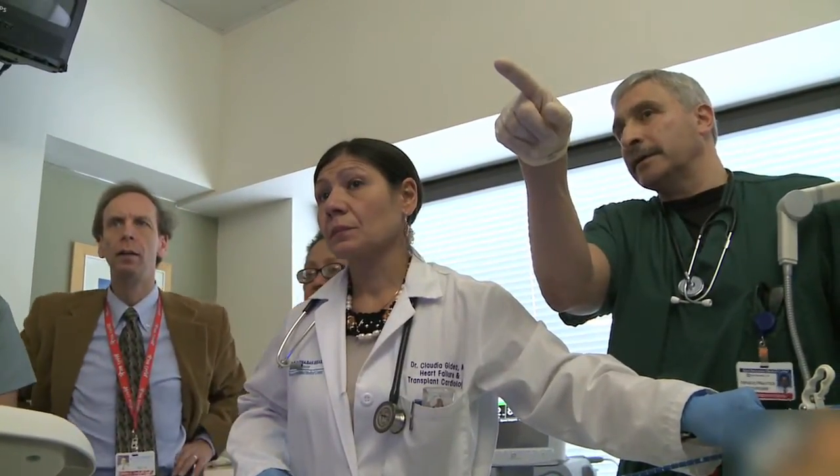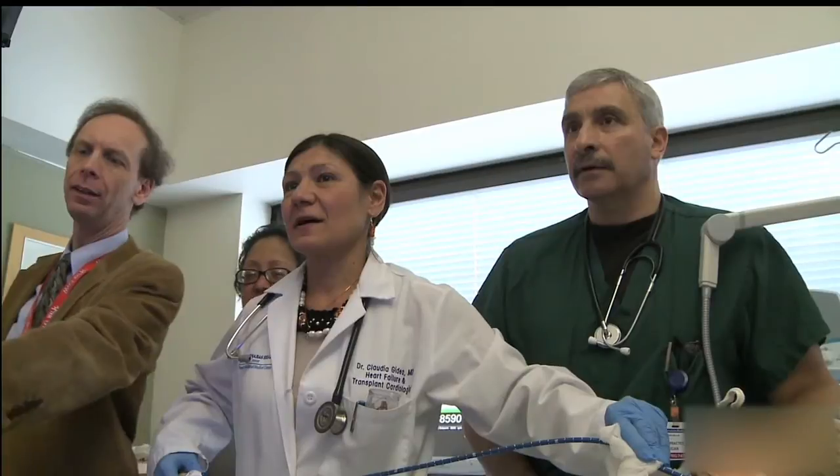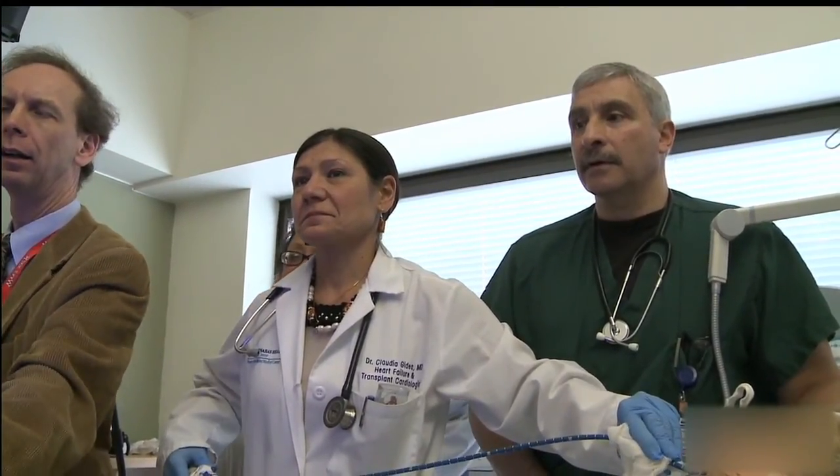The first 24 hours, as most surgeons know, is a time when most surgical complications will happen that need to be addressed. As a surgeon, the bottom line is I need to know: is there a technical problem that needs to be addressed by me, or does it need to be addressed with speed adjustments or a change in the drug cocktail to improve right heart failure? The Imacor probe allows us to see cardiac function in the early perioperative period when we worry the most, and this has been a game changer with respect to the management of these post-operative patients.